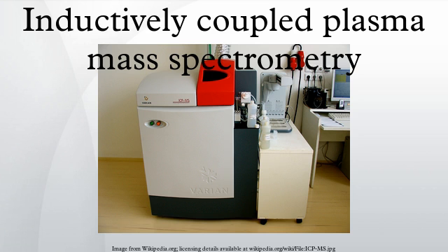It is also beneficial for a clinician to utilize speciation analysis from a preventative standpoint. Many patients, who suffer from elevated levels of certain metals, do not know when or where the exposure incidents are occurring. By identifying the exact species, a physician can better narrow the search for possible exposure sites, therefore helping the patient to avoid certain areas in the future.